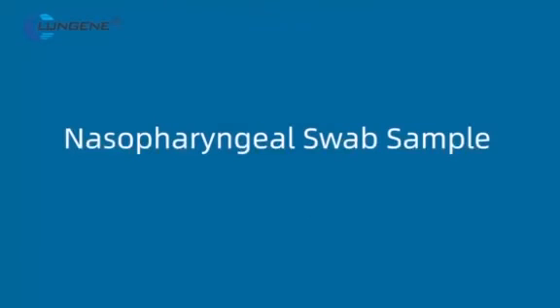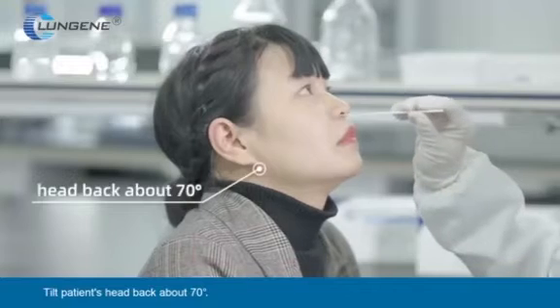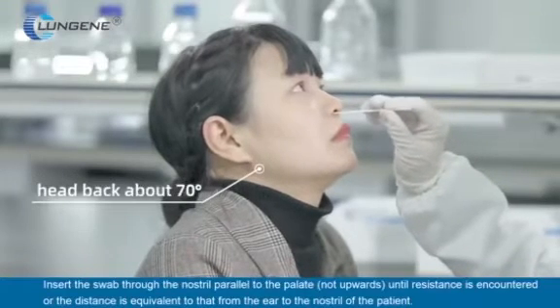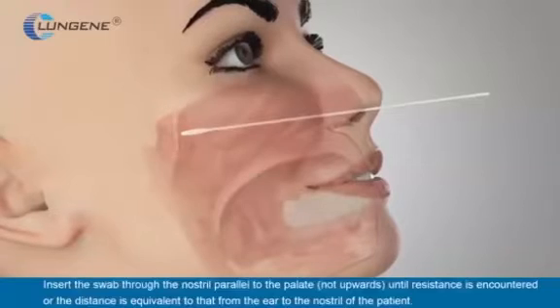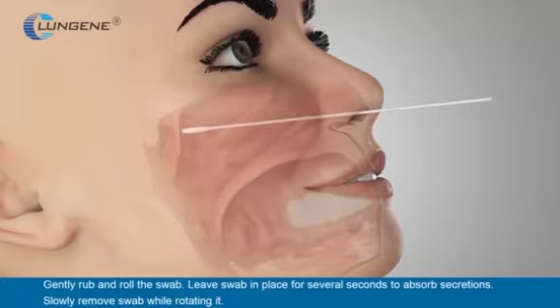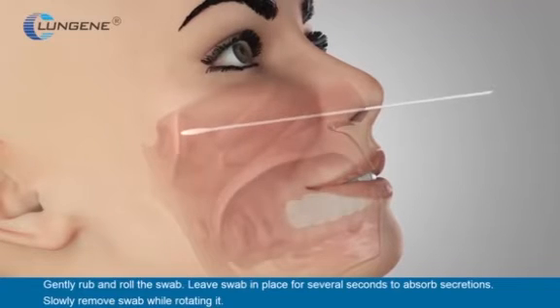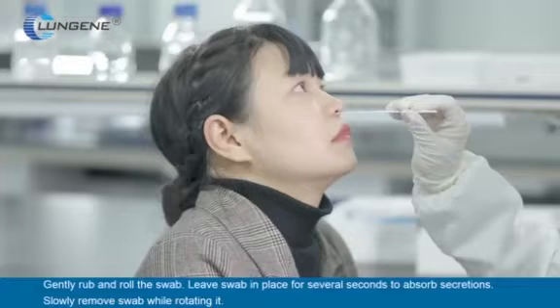Nasopharyngeal swab sample. Tilt patient's head back about 70 degrees. Insert the swab through the nostril parallel to the palate, not upwards, until resistance is encountered or the distance is equivalent to that from the ear to the nostril of the patient. Gently rub and roll the swab. Leave swab in place for several seconds to absorb secretions.